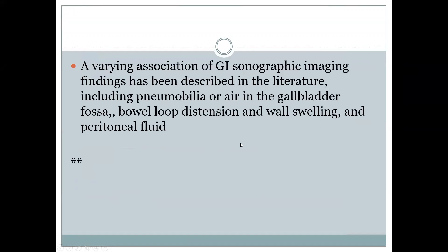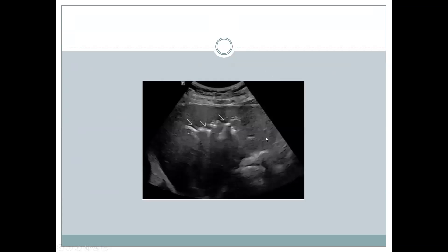The next modality is ultrasound. A combination of sonographic imaging findings has been described in the literature, including pneumobilia or air in the gallbladder fossa, bowel loop distension and wall thickening, as well as peritoneal fluid. However, there are many limiting factors with ultrasound, including body habitus and excessive bowel gas. Here you can see echogenic linear areas in the liver, which represent air in the biliary tree.